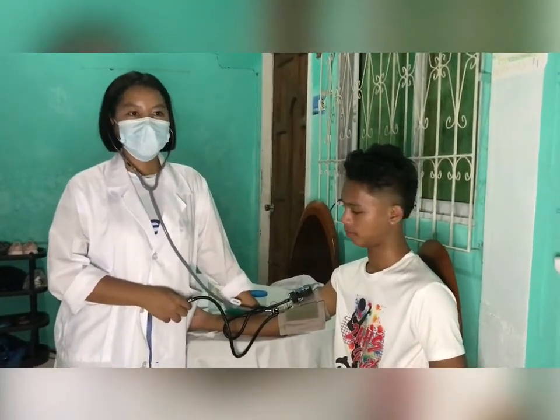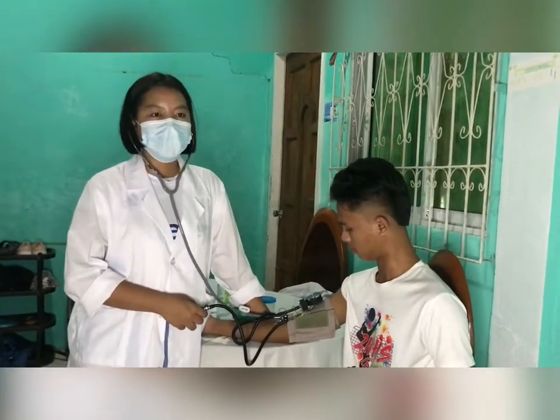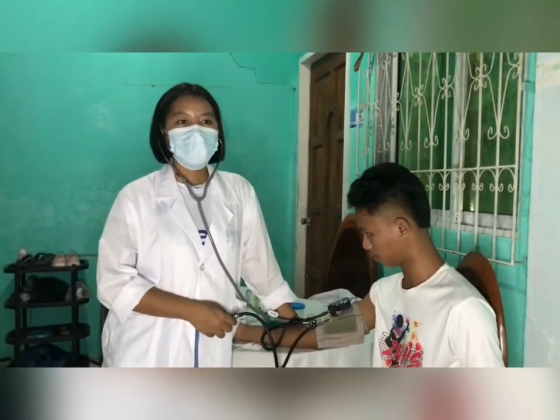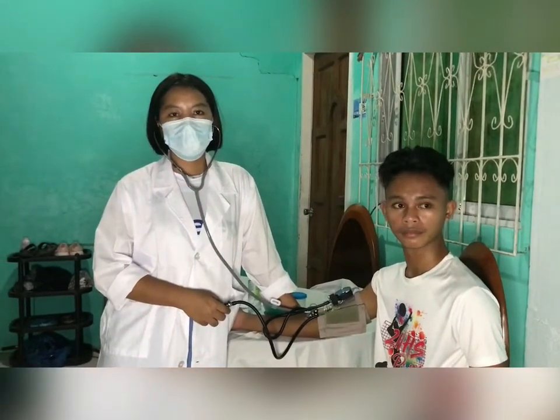The sound will slowly increase in intensity. Continue to deflate the cuff, noting the point at which the sound disappears. Listen for 10 to 20 mmHg after the last sound. Then allow the remaining air to escape quickly.